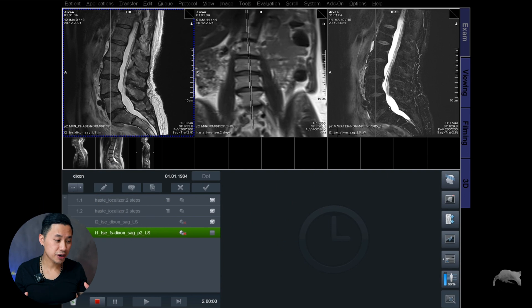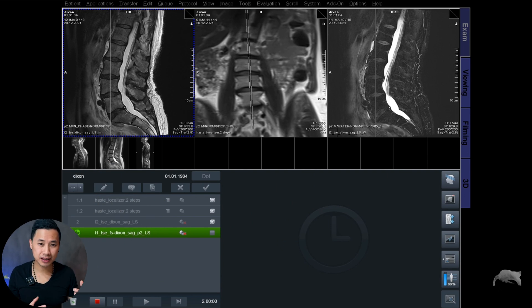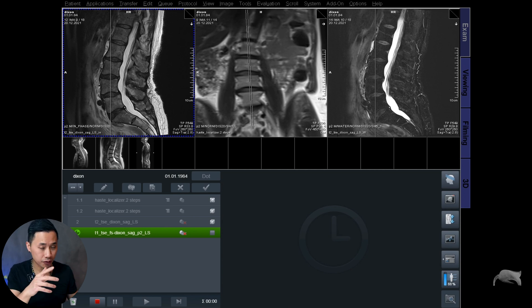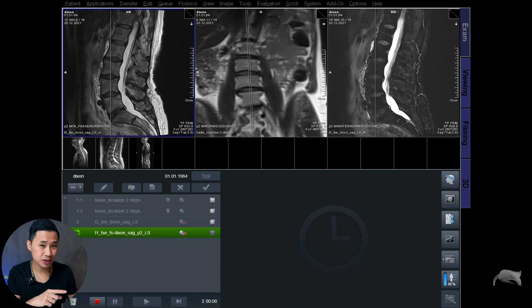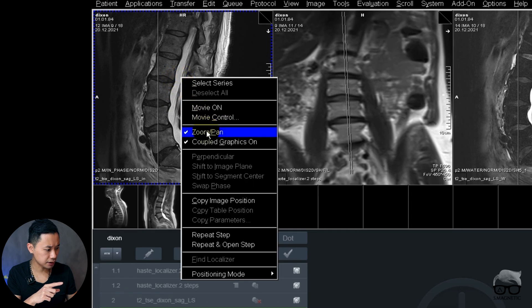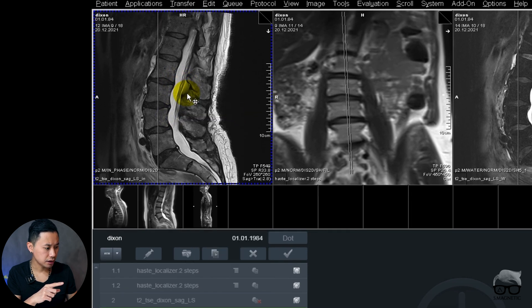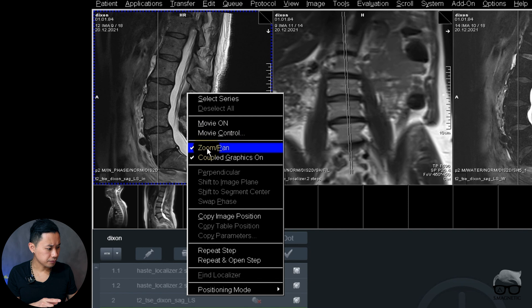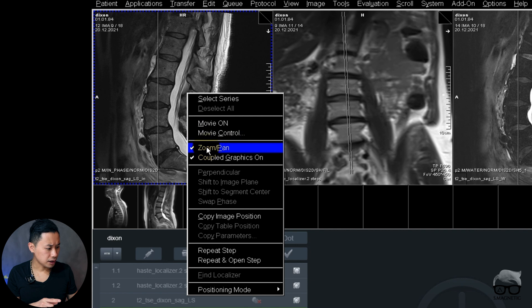Let's go to the scanner. We are currently at 3T — this doesn't matter, this works on 1.5T and 3T, old software, new software, it will work. So one thing before we continue: this will not work if you have the zoom/pan on. If that is on it will not work — you see you only move the whole slice. So you have to turn it off.